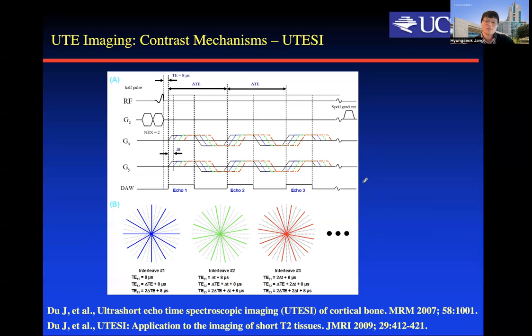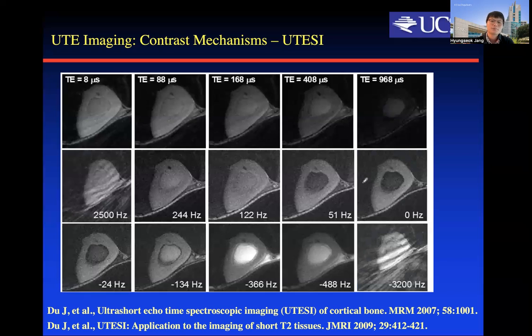It's not too long, but 3D maybe takes longer. So these are some representative images, right? Actually, there are hundreds of images, not only 5. But you can see if you go to the late echo, your bone signal decays, right? And then your fat signal is still there.